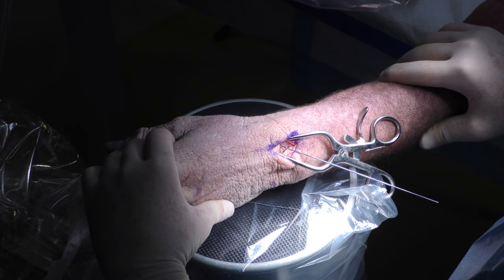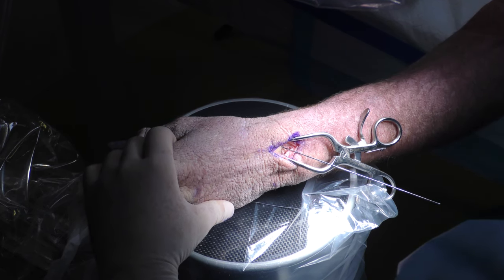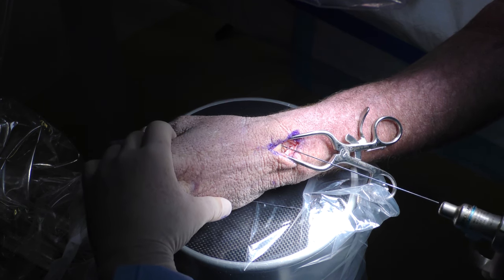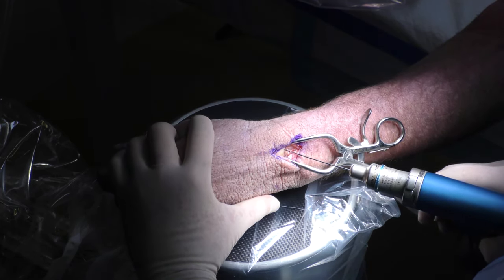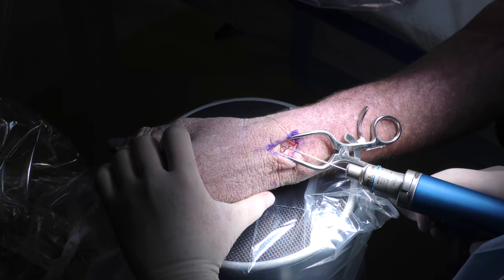And so at that point, you can advance it. I like to advance using the C-arm, because then if your estimation of where you are is off, you can stop what you're doing.